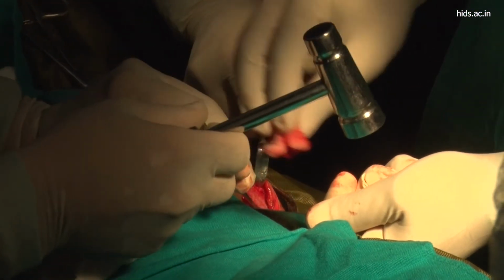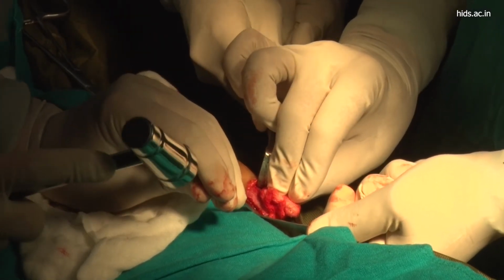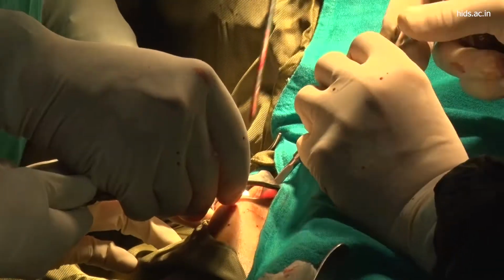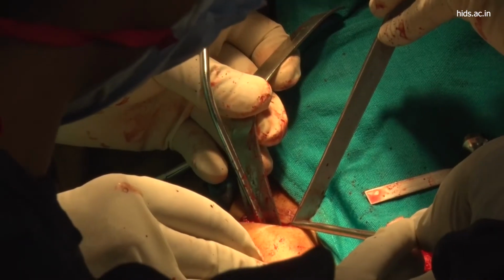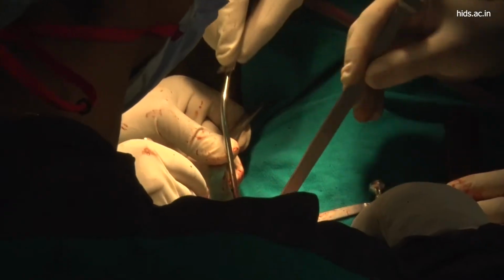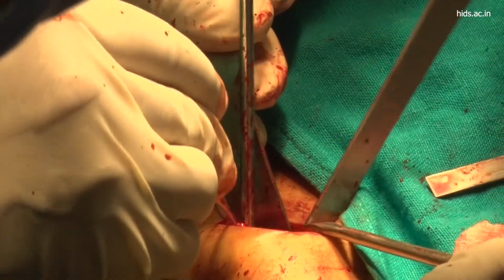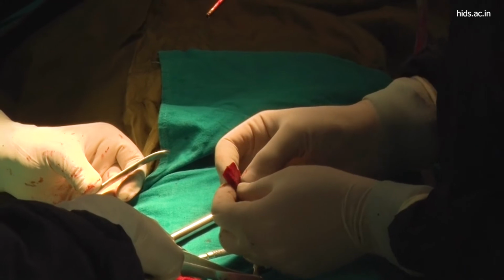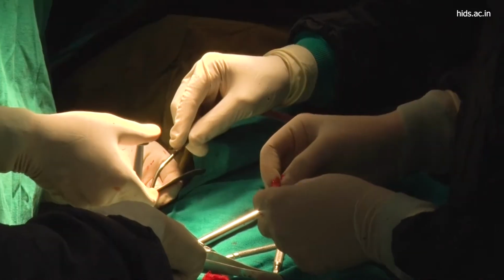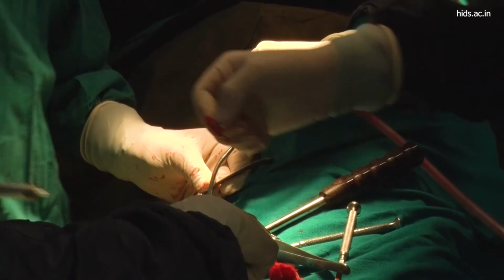This is how we have scored the harvest site with chisel and mallet. We have to go deeper so that we can take a good thickness of cancellous bone along with the overlying cortical plate. Now we will finally separate the graft from the underlying bone very carefully.